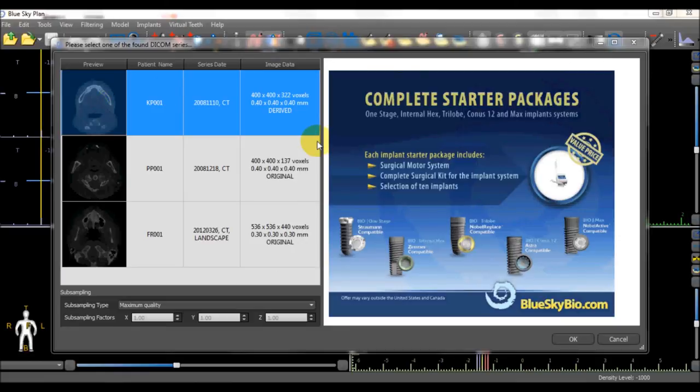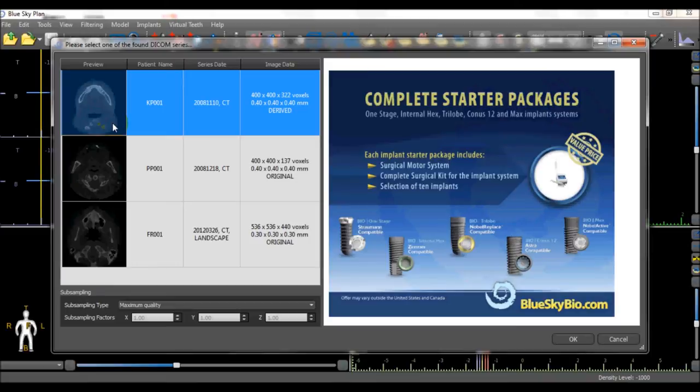We are going to load the first set of DICOM images and this can be done by double clicking the DICOM series or by clicking it once and then clicking the OK button in the bottom right of the dialog box.